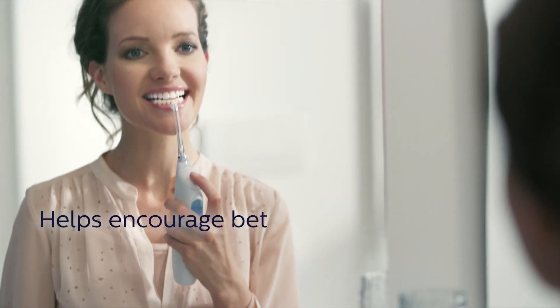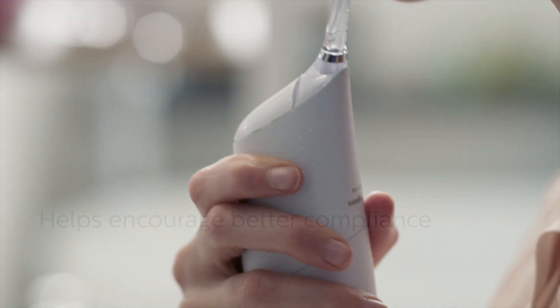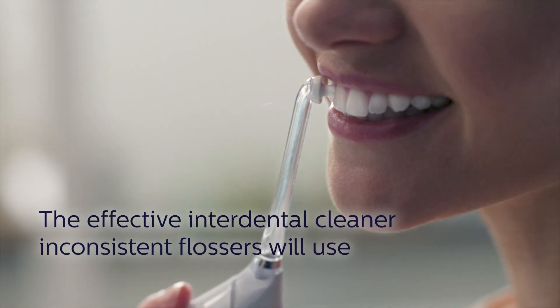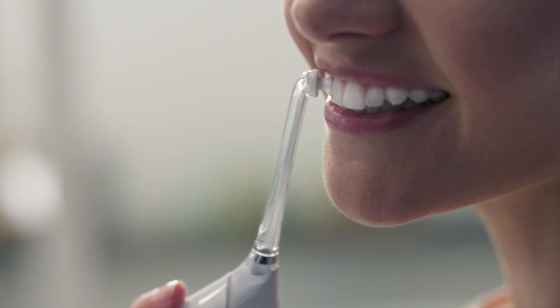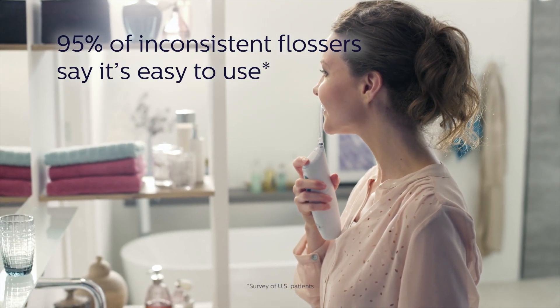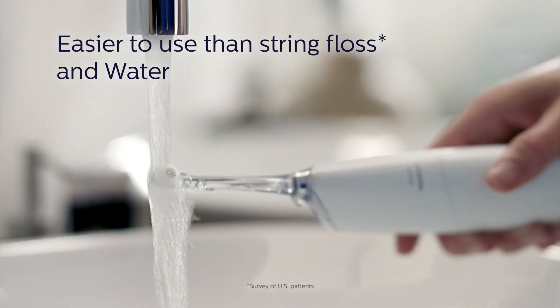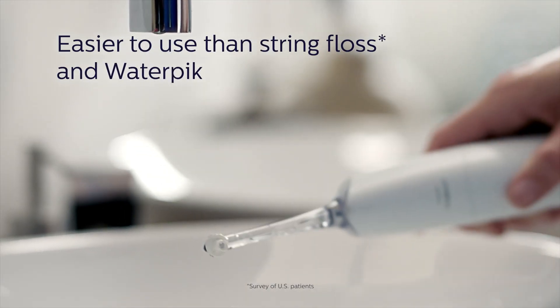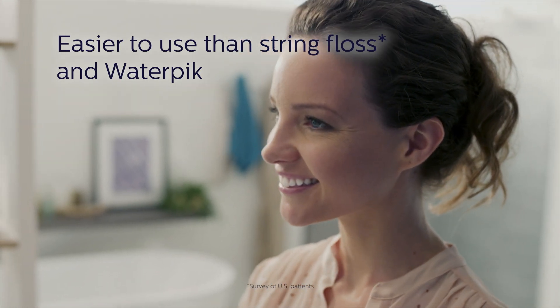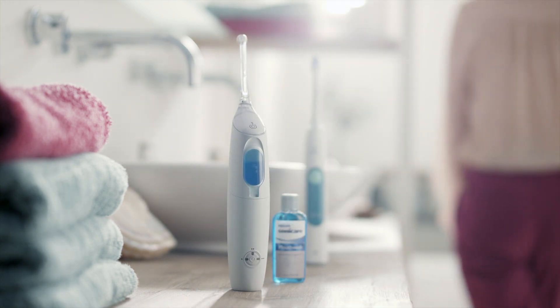Of course, with interdental care, the best solution is one your patients will use regularly. By providing a quick and complete cleaning experience, Air Floss Pro helps foster better patient compliance. 95% of inconsistent flossers surveyed said it's easy to use. 89% said it was easier to use than string floss. And 82% said it was easier to use than a water pick. Improving gingival health has never been so simple.